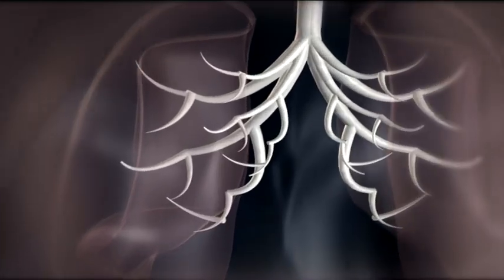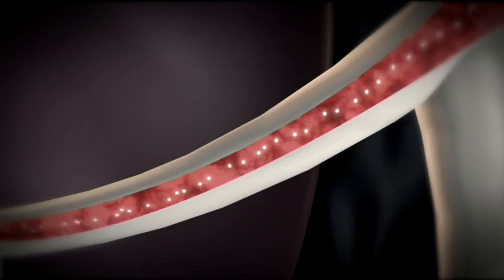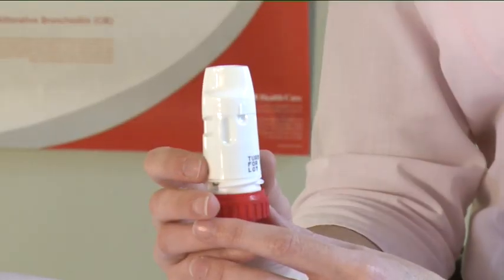The amount of medicine that is inhaled is very small. This means that you may not be able to taste it after inhalation. If you are to take a second inhalation, repeat the process as before.